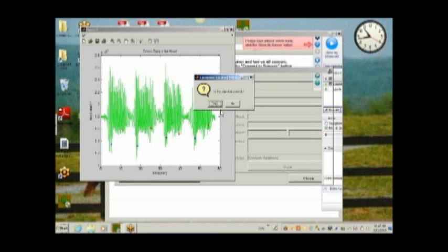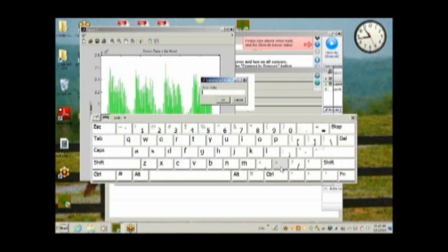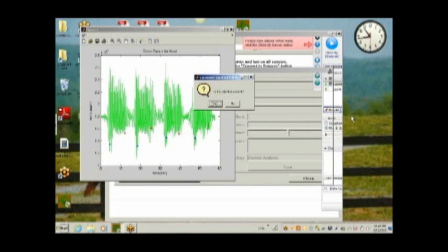For the purposes of demonstration, we'll go back to our default selection of 0.1. Again, in most situations, you will not need to alter the selection. However, if you are working within a short barn aisle and perhaps were not able to get 6 contiguous strides before the horse stopped and turned around, Lameness Locator may not select that segment to include strides for the analysis.